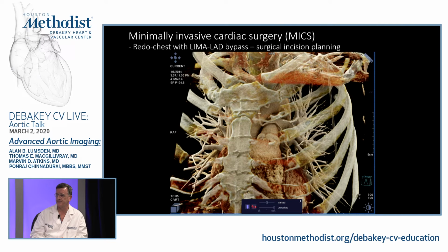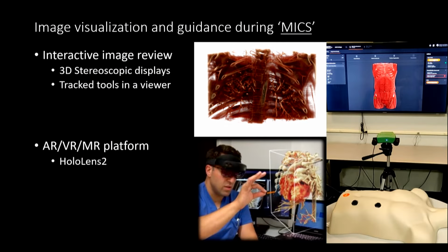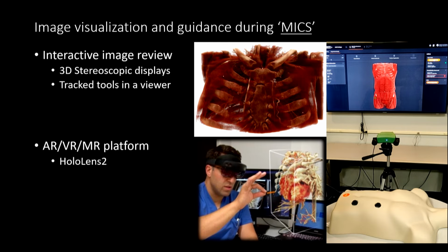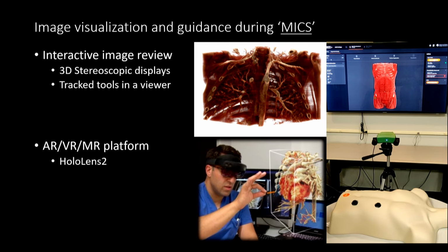So now we are talking about taking this rich data that's already there in the CT, and using it for open surgical planning. And we don't have all these fancy hybrid imaging equipment in these open operating rooms. For example, here we have 3 hybrid ORs and maybe another 12 open rooms. So what we are looking at is how we can get this information from CT linked to the surgical view or the surgeon's hand. Instead of you scrubbing out and looking at the image on a PACS PC, how we can enable you to interact with these images from the surgical field, preferably in a sterile environment.